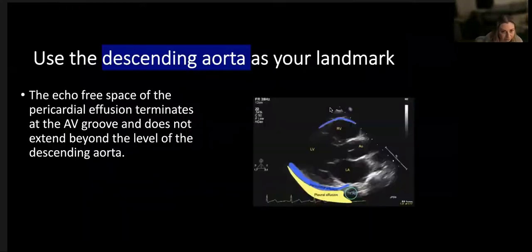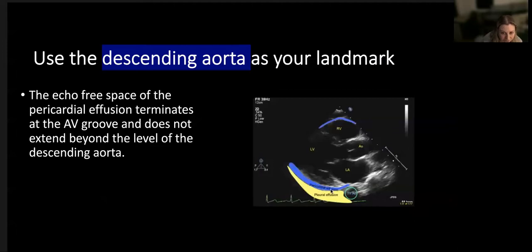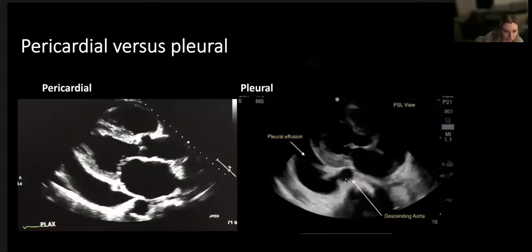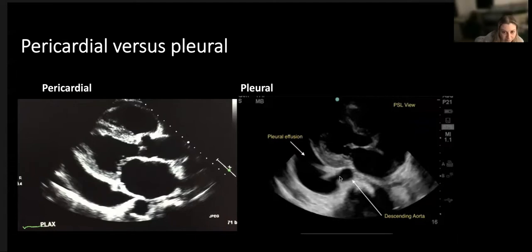We use the descending thoracic aorta as our landmark. If that anechoic area comes up to it but drops down posterior to the descending aorta, that is pleural fluid. If it comes up anterior to the thoracic aorta - closest to the probe - that is a pericardial effusion, and it tends to come up to a point just below the left atrium. If you're really unlucky you might have both. Here is a pericardial effusion anterior to the thoracic aorta, and here is a pleural effusion dropping down posterior to it.